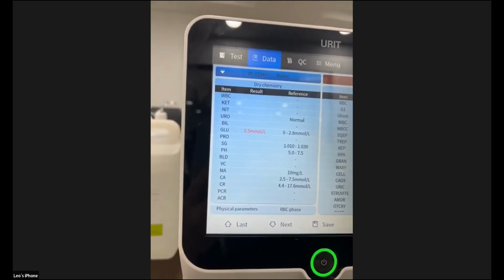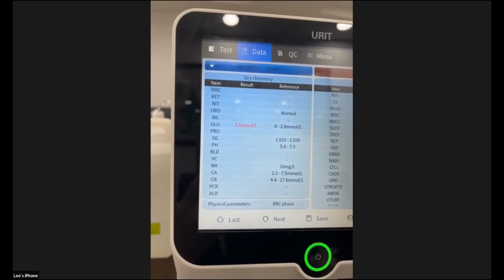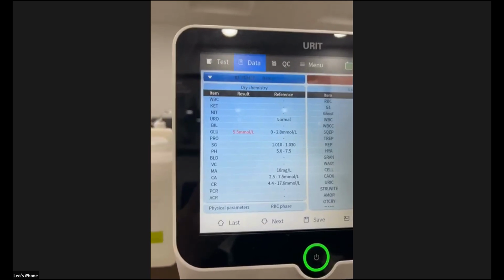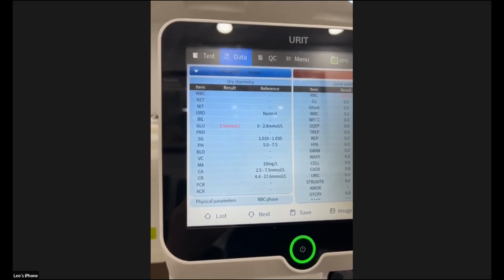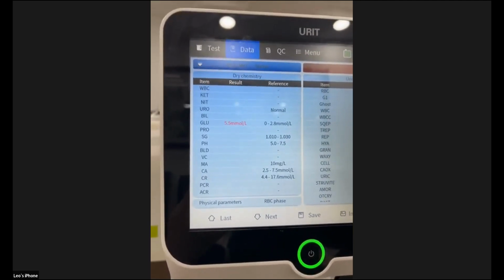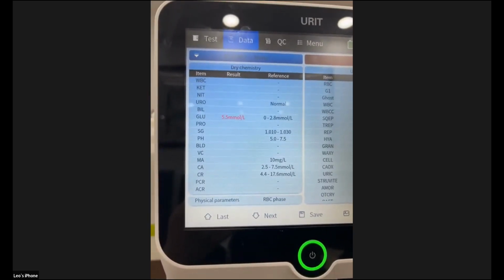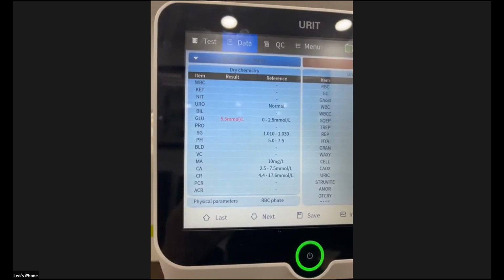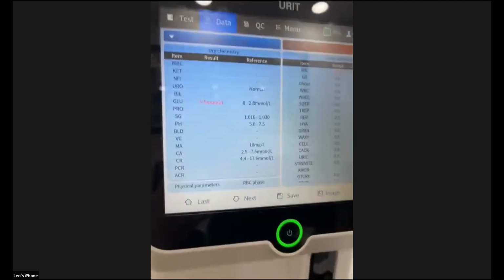I think it is a possible discussion idea that maybe we can suggest to the R&D department, and then maybe in the future we can upgrade the display of the result by upgrading the software. Because last time, when we installed the analyzer in LabAid hospital, there was a big issue with these things. Then we needed to make changes in the LIS software.